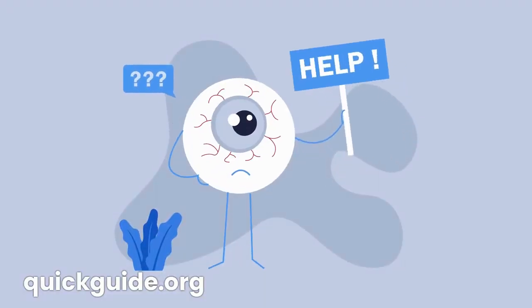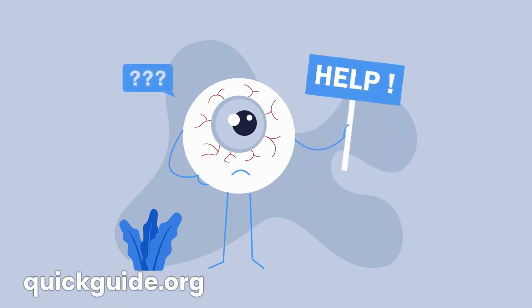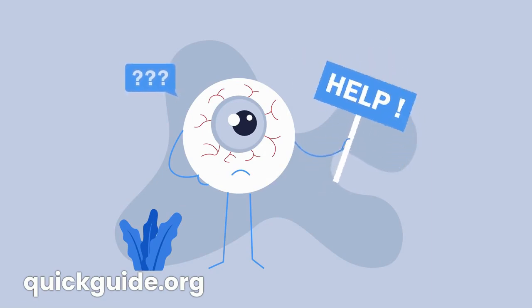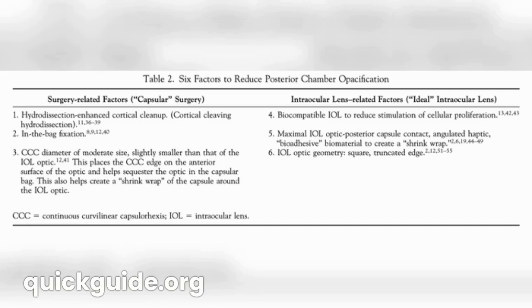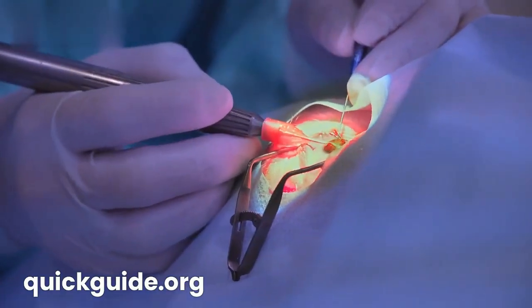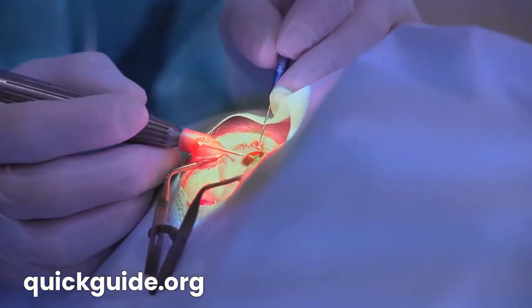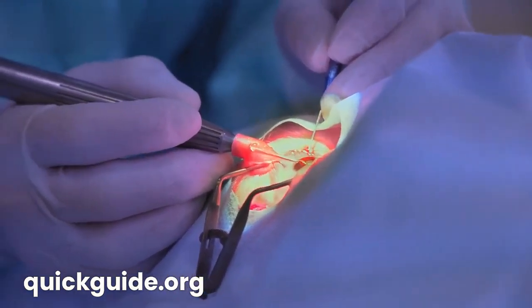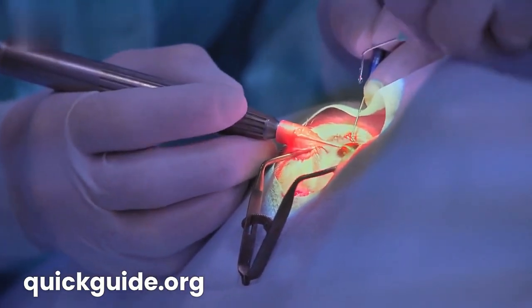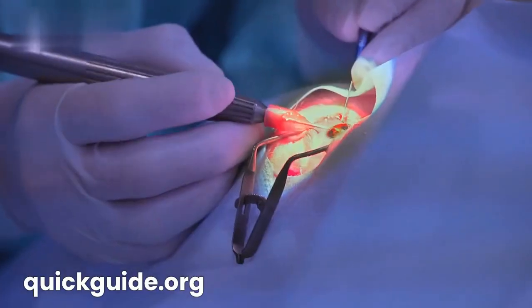Post-operative capsular opacification involving both posterior and anterior capsule is not related to IOL material alone. David Apple had proposed 6 factors for the reduction of PCO, which were 3 IOL related and 3 surgeon related. Among the surgical related factors are in the bag implantation, a thorough IA and cortex removal, and a capsulorhexis of less than 1 mm of the IOL optic size, to help have a shrink wrap effect of the anterior capsule on the IOL optic.